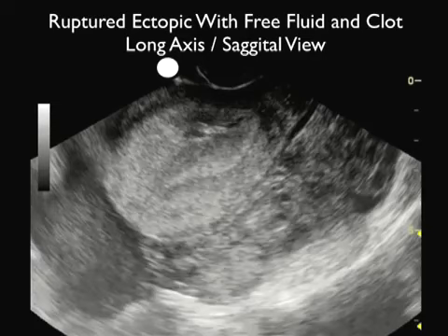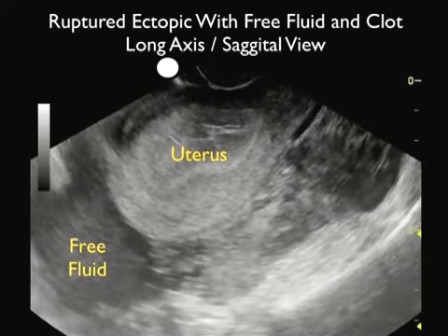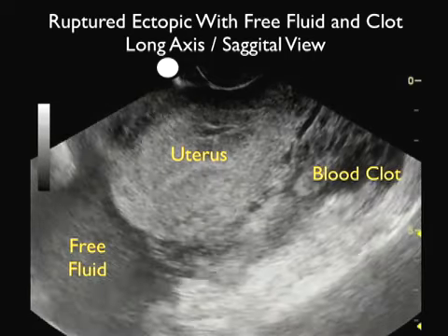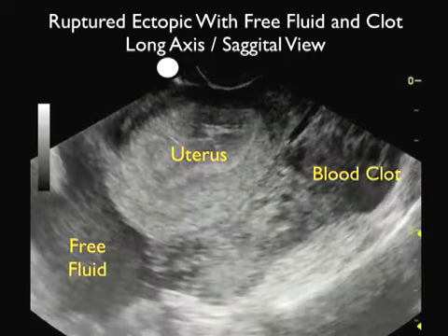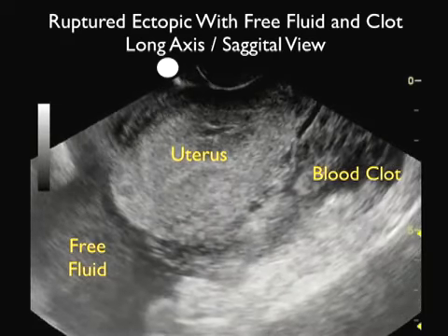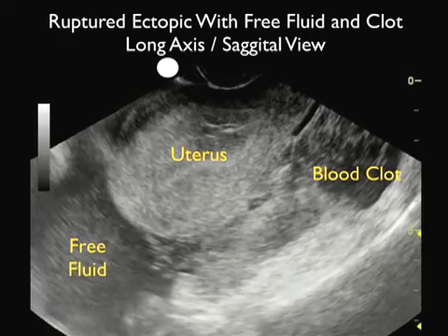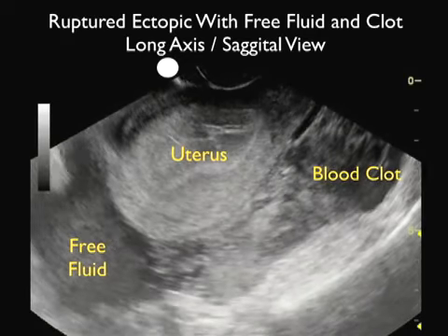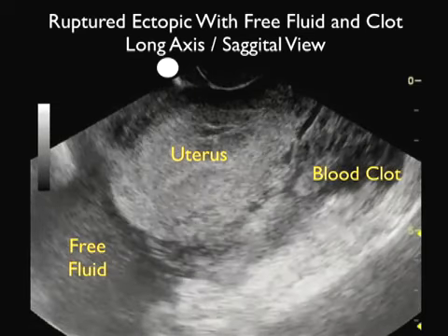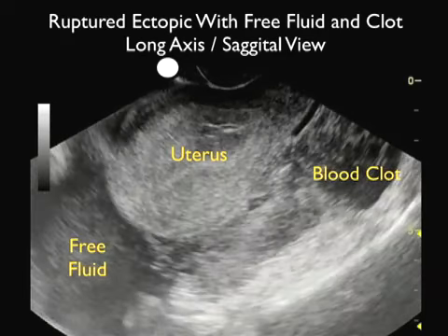Again, we're looking in a transvaginal long axis orientation, and we see the uterus. Notice again, we fail to appreciate the presence of an intrauterine pregnancy here, and we see a large amount of free fluid surrounding the uterus. Notice the clotted blood that has more of an echogenic appearance, in contrast to the darker or anechoic appearance of the free fluid as seen at the upper part of the uterus. So, a large amount of free fluid and blood clot without a visualized intrauterine pregnancy, very suspicious again for ectopic pregnancy.